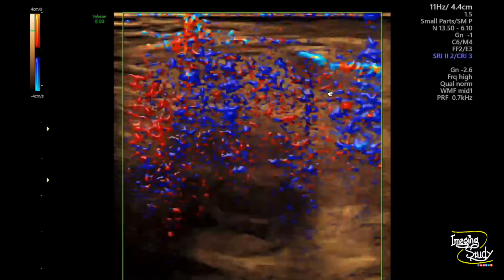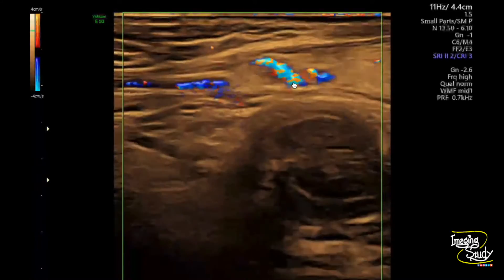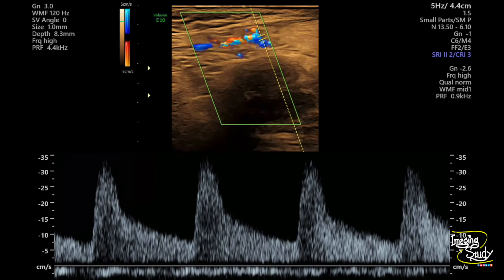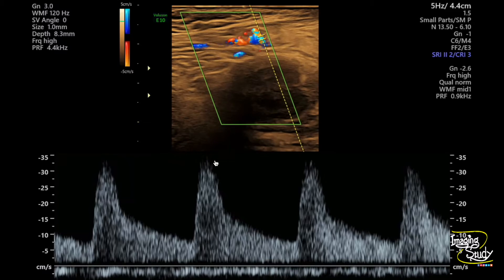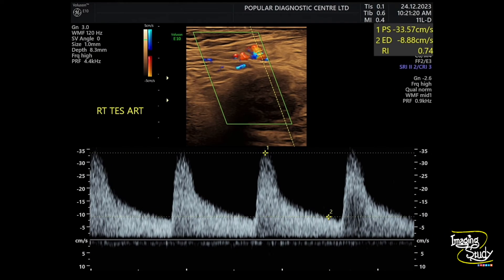These are prominent testicular vessels, and we want to take a spectral sample from this vessel. We chose this prominent testicular artery above the testis and you can see high-velocity monophasic flow. In normal cases, the testicular artery will show less than 25 cm/s of flow, but here the flow velocity is more than 30 cm/s with an increase in diastolic flow.